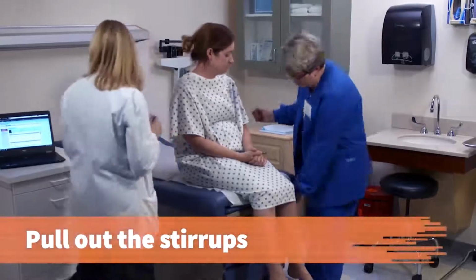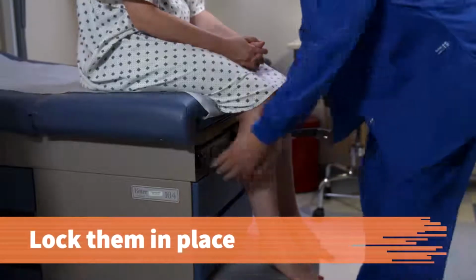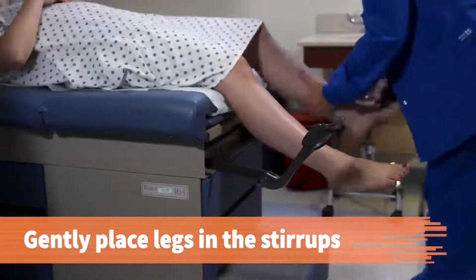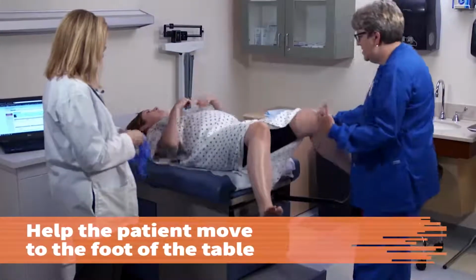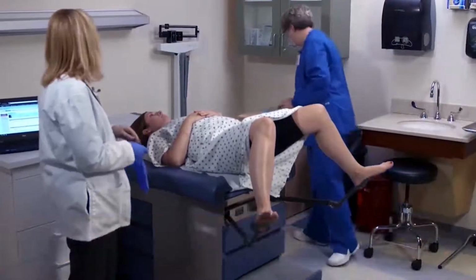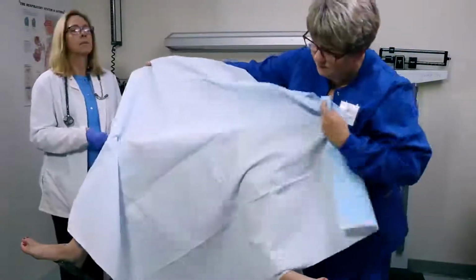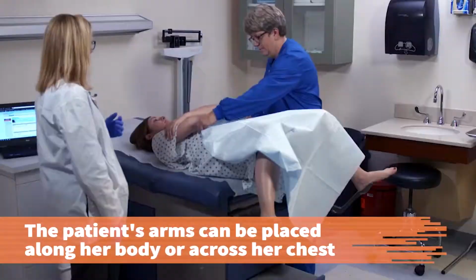Sure. Pull out the stirrups, adjust their extension length for the patient's comfort, and lock them in place. Help the patient lie face up on the table. Gently place the patient's legs in the stirrups, checking for comfort. Have the patient move toward the foot of the table with her buttocks on the bottom table edge. Some offices may stock cloth or paper stirrup covers to protect the patient and make the position more comfortable. The patient's arms can be placed alongside her body or across her chest.